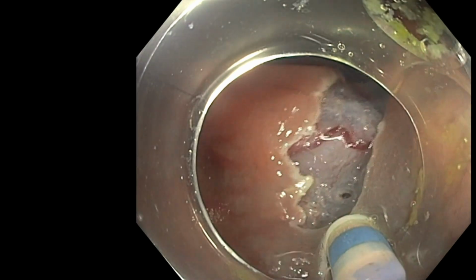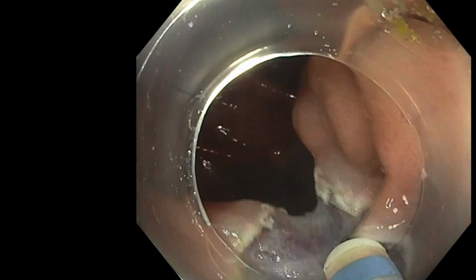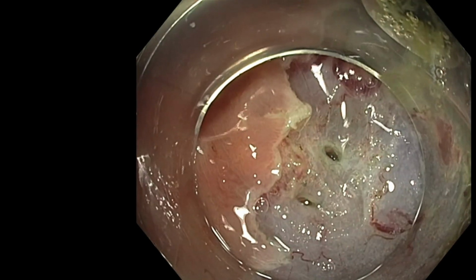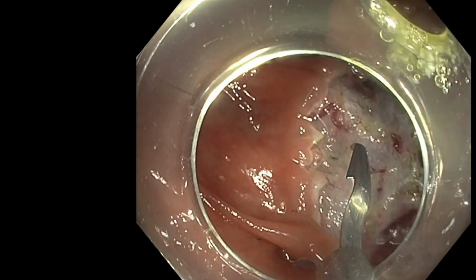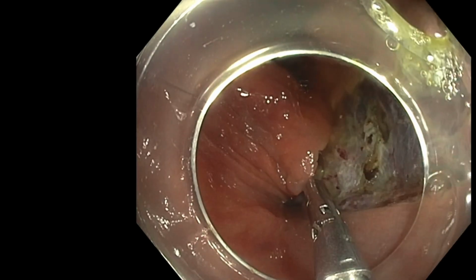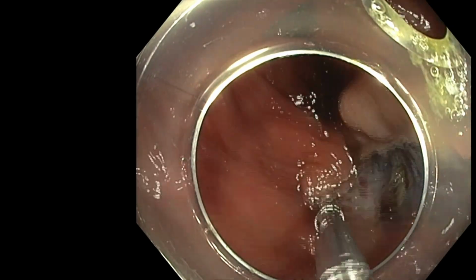You should achieve your incision, do your trimming, dissect a little in order to open the space, and when the holes are far from the area you want to dissect, you have to put a clip to close the area of perforation without preventing the end of your resection.